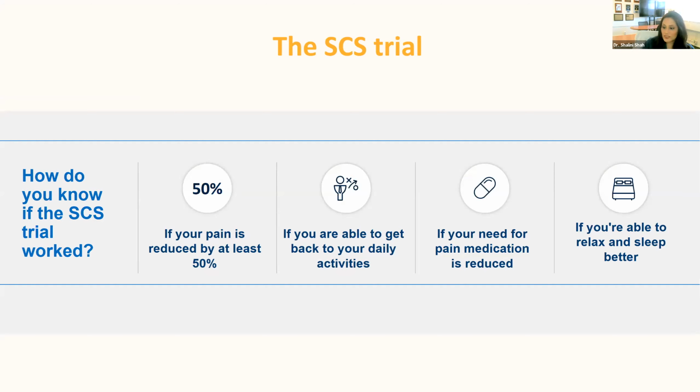There's no surgery, there's no incision, just a small puncture. We tape you up, and typically we call you every day just to check on you. Then we're going to see you back. What we're looking for are three big things, for me at least. I'm looking for at least a 50% reduction in your pain. I'm looking to see, are you more functional? Meaning, were you able to take a walk around the block, do more chores, or go to work and function more appropriately because you had better pain relief? And the last thing I'm looking for is a decrease in your medication use.